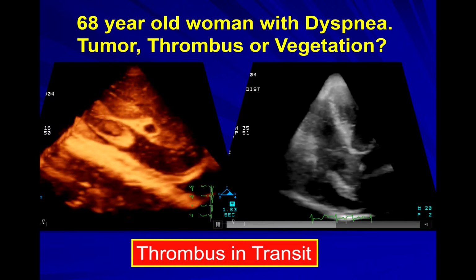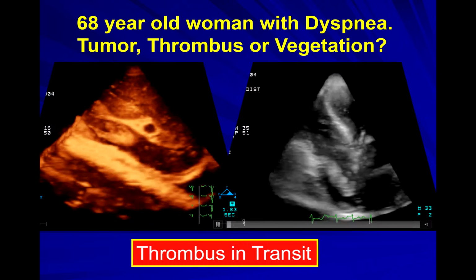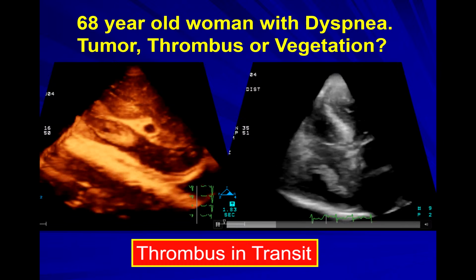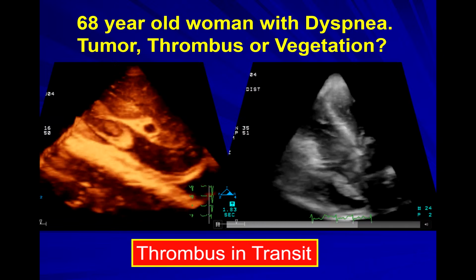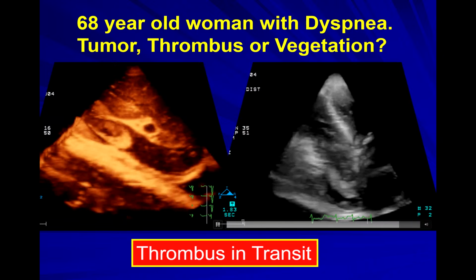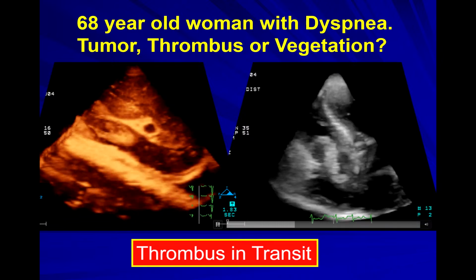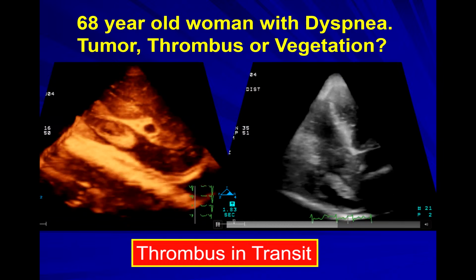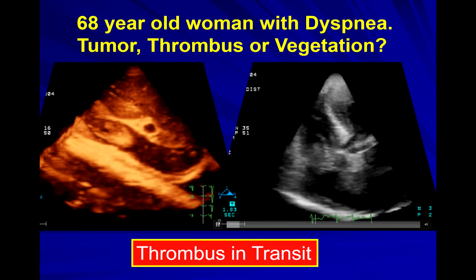This is a classic example of a thrombus in transit, and because of its size, if this patient was a surgical candidate, you would go in and retrieve it, because this will cause a saddle pulmonary embolus once it gets there. You can see the RV function is still normal in this particular case, so pieces have not broken off yet. So honestly, you would also be saving the RV if you went in and took it out, if the patient is appropriate for that therapy.